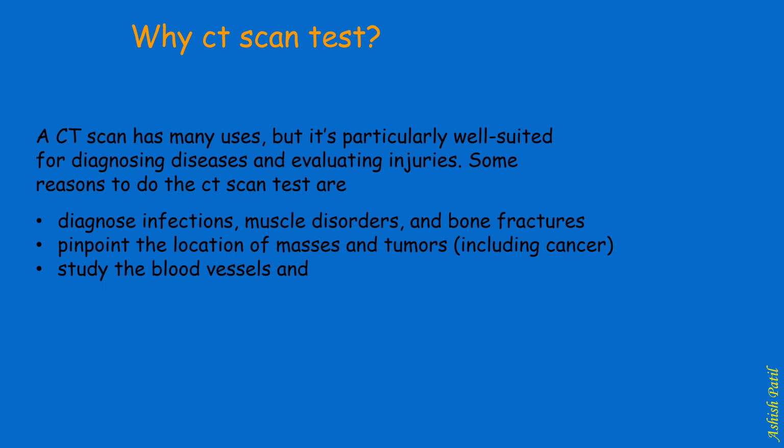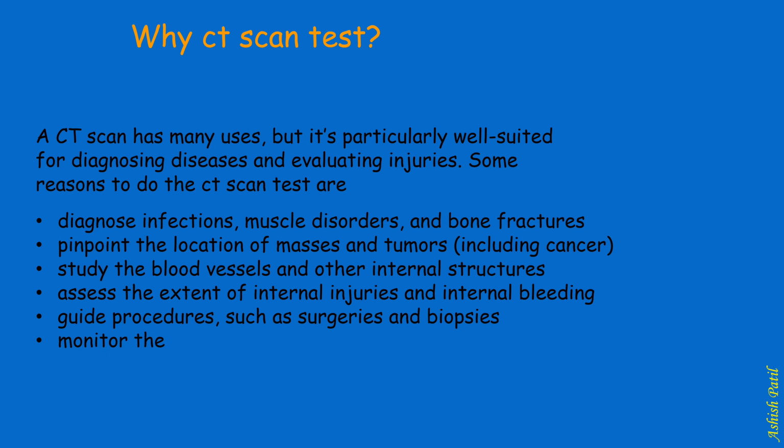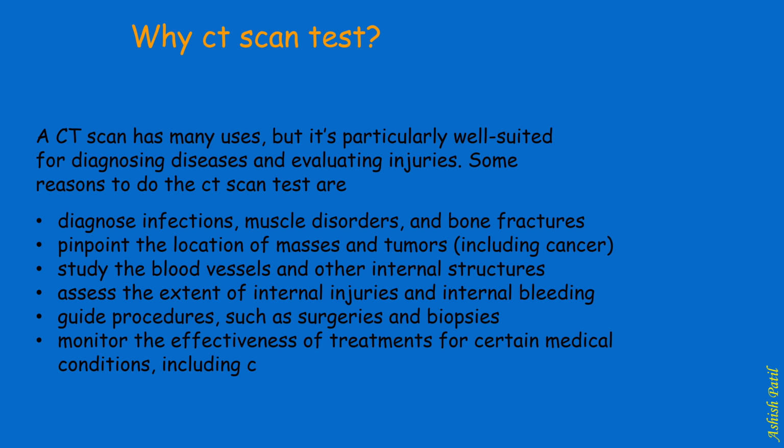Study the blood vessels and other internal structures. Assess the extent of internal injuries and internal bleeding. Guide procedures, such as surgeries and biopsies. Monitor the effectiveness of treatments for certain medical conditions, including cancer and heart disease.